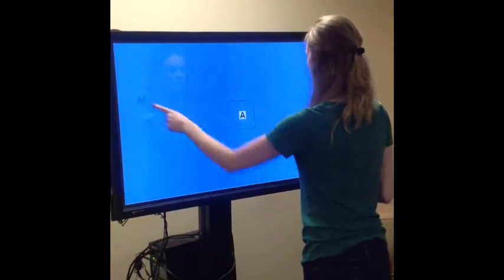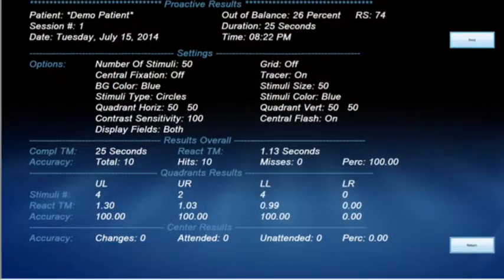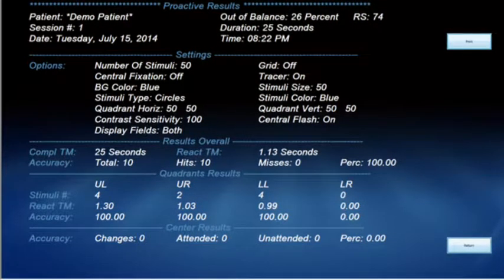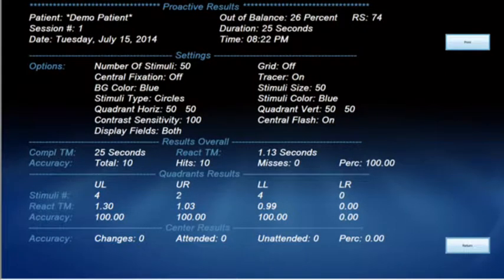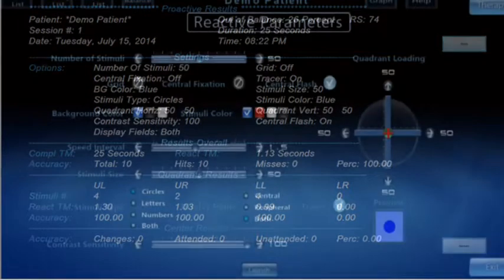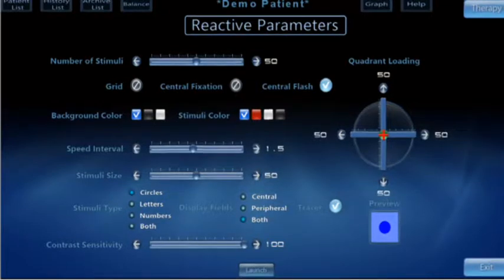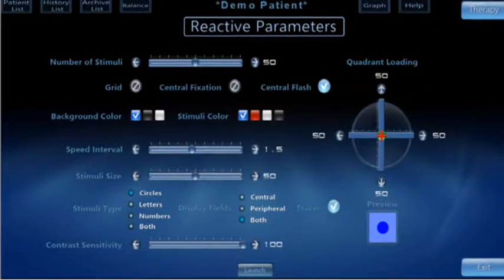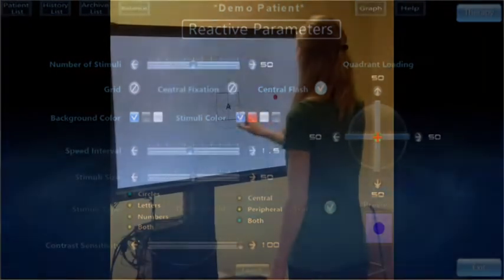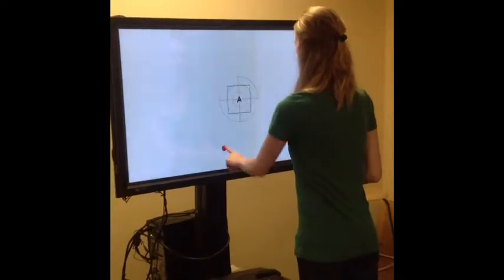In the Proactive program, the stimuli stay on the screen until the patient touches them. The results are shown when the patient finishes the program. Here are the parameters for the Reactive program — the parameters are the same as the Proactive program. In the Reactive program, the patient has to touch the stimuli before they fade away.